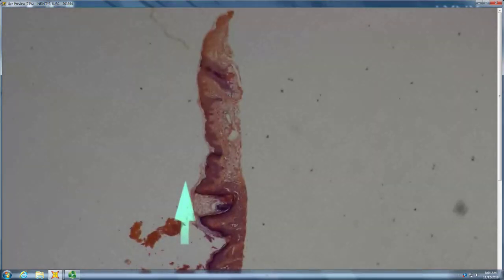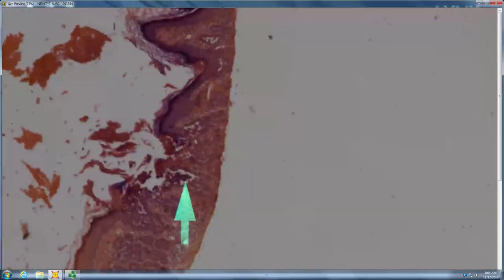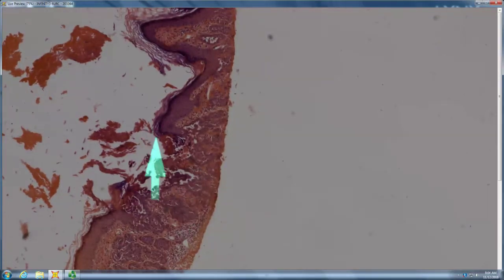Okay, a little shave. Not my fault, I just read them. Is that just a little like warty dyskeratoma? There's definitely acantholytic dyskeratosis, so if it was solitary, it could be a warty dyskeratoma. But this person actually has brownish red crusty papules all over the V of his chest, and it's Darier.